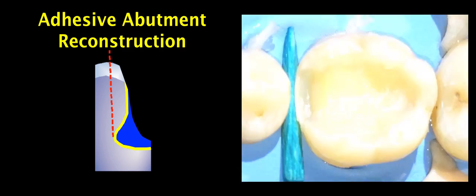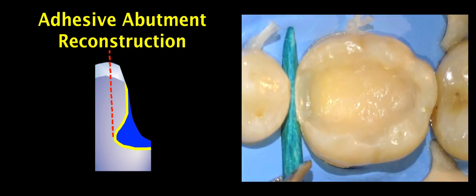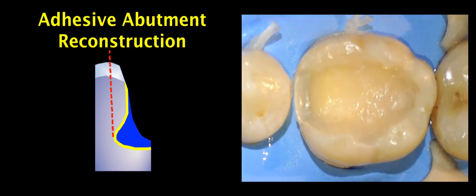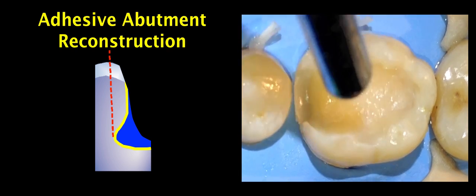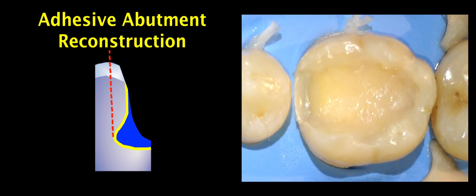We see the abutment after cleaning and removing the gel and finishing. Everything is covered by composite. The enamel is not clean, we have bonding agent and in some areas a little bit of composite on the margin. And this we want to avoid, we want to finish our margin in a subsequent step.